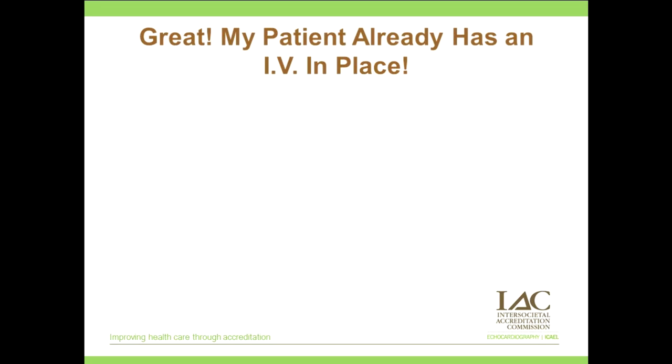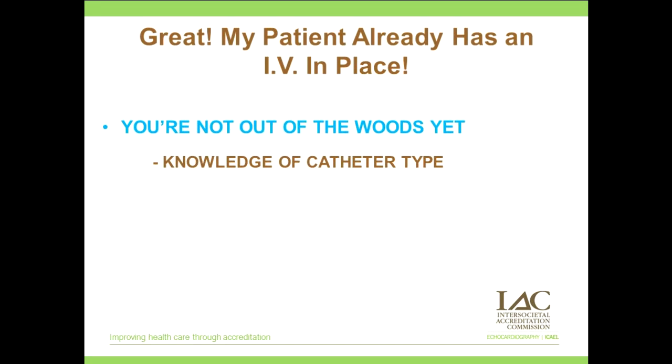Okay, so when you're in the situation where the patient already has an IV in place, for example, an inpatient in a hospital setting, the sonographer still needs to know certain things. First of all, what kind of catheter is in place? The second question is, is it patent? A great example of this is the day I helped out at the hospital. Normally working in an outpatient clinic, I'm not used to scanning patients who already have an IV in place. Unfortunately, our outpatients don't walk in with an IV.